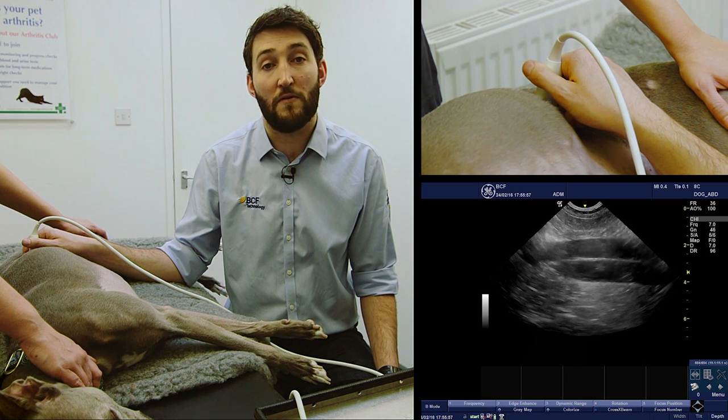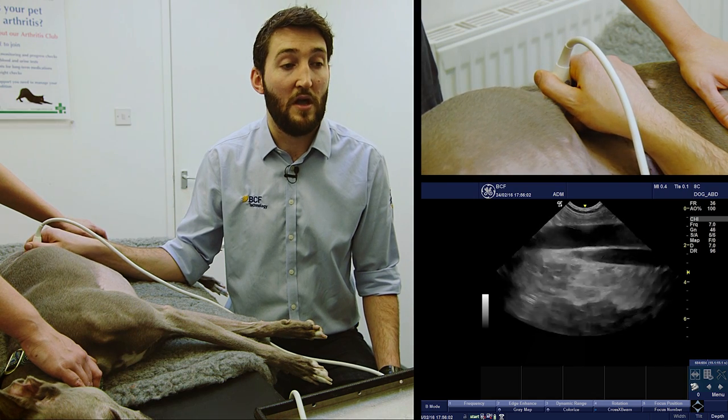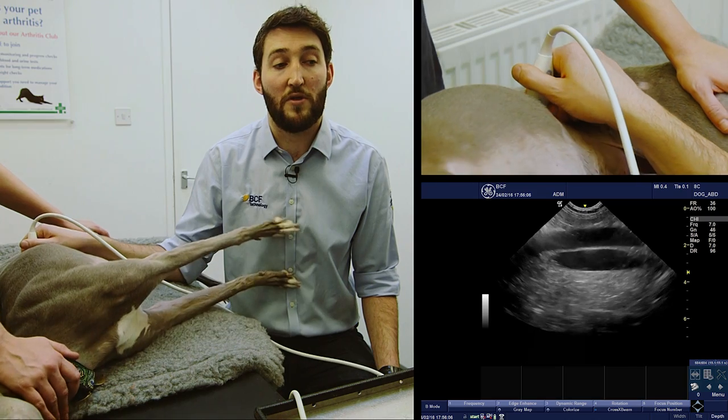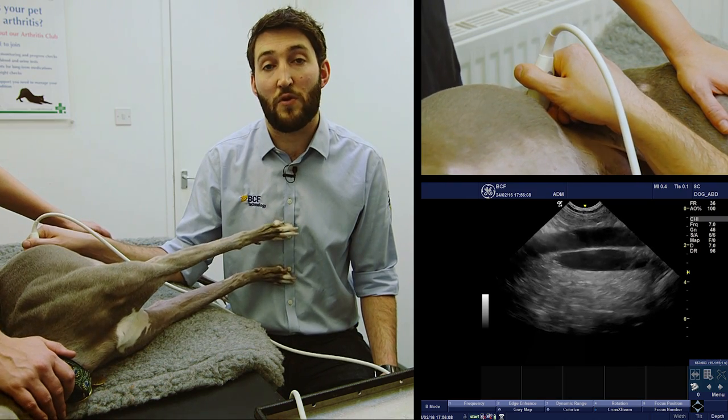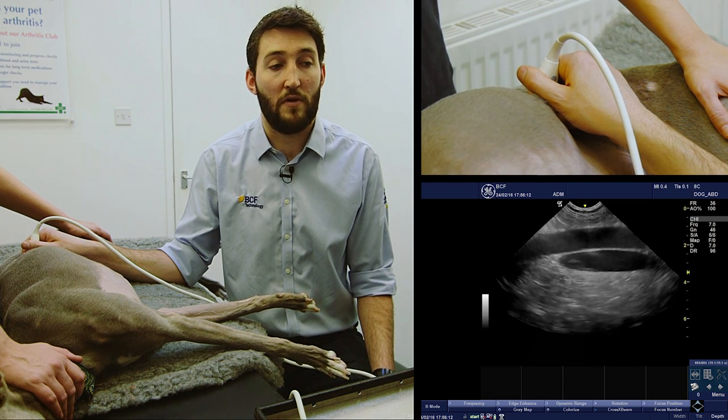The other way you can tell those two vessels apart is if you just apply a little bit of transducer pressure — you can see that we can actually squash the lower vessel. The lower pressure system of the vena cava means we're able to squash that vessel with our probe, whereas the higher pressure aorta we're unable to do so.